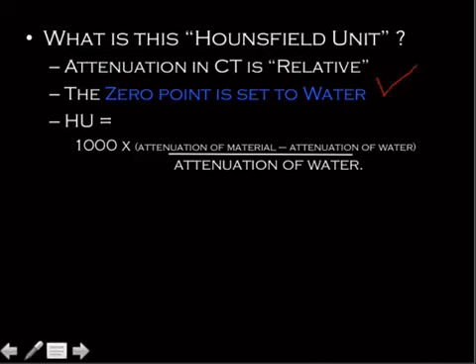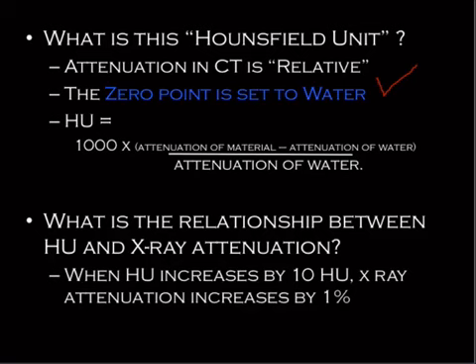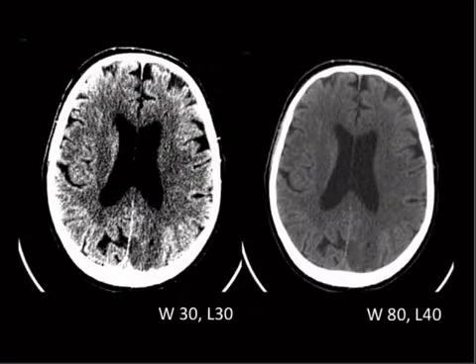It is based on density, but the scale is relative to water. It's not like an inch is an inch is an inch kind of thing. It's all relative to something else. Understand this relationship too: what's the relationship between a Hounsfield unit and X-ray attenuation? When you increase a Hounsfield unit by 10, you increase X-ray attenuation by 1%. Just something to know. All right, so let's look at two different windows here.